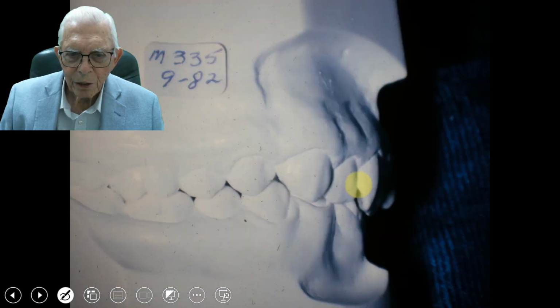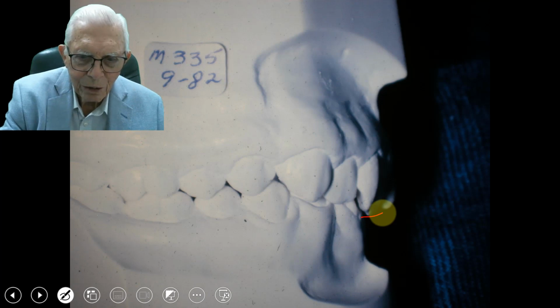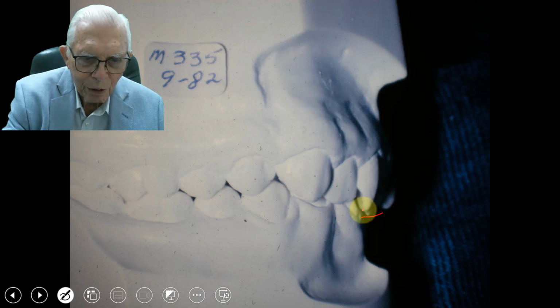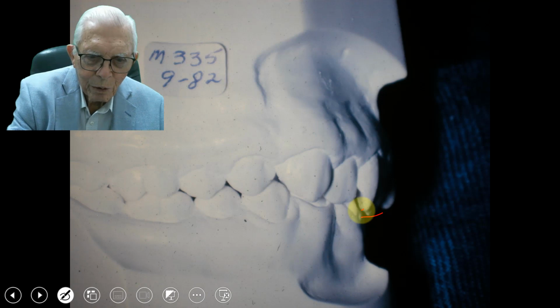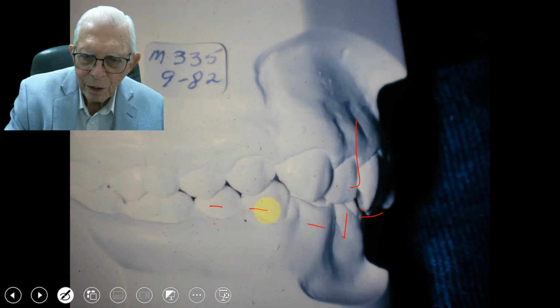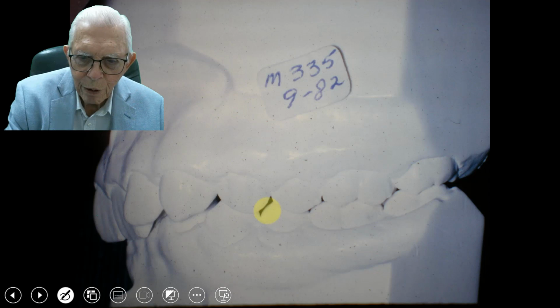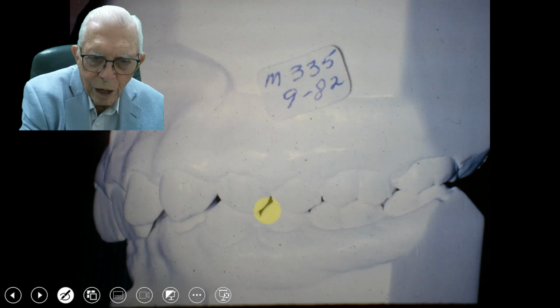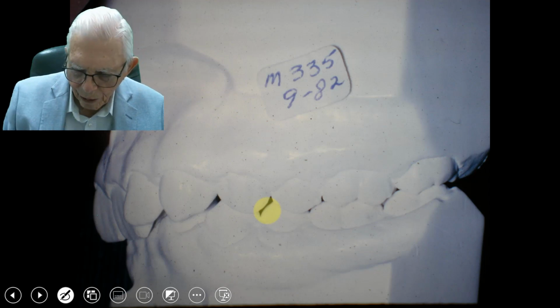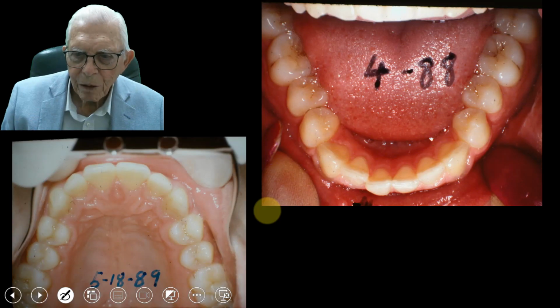This was 1982, and you can see the deep bite. This is the Class 2, Division 2, all tucked in back here, and we're going to open this up and this down, and it'll bring this forward a little bit, but not as much as we did. But we'll bring the lower jaw on out quite a bit, instead of pulling the upper one back like that. So here we go with this.